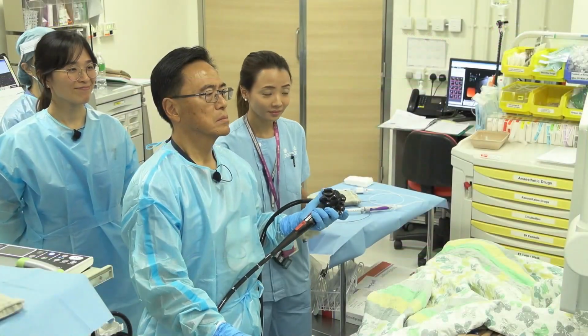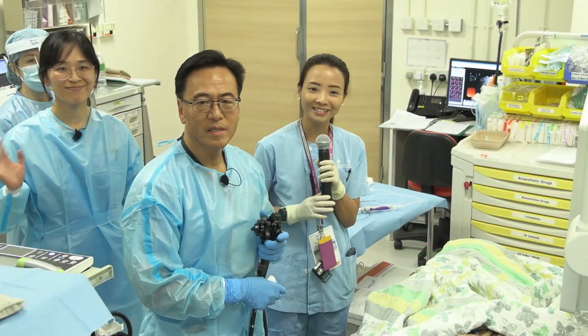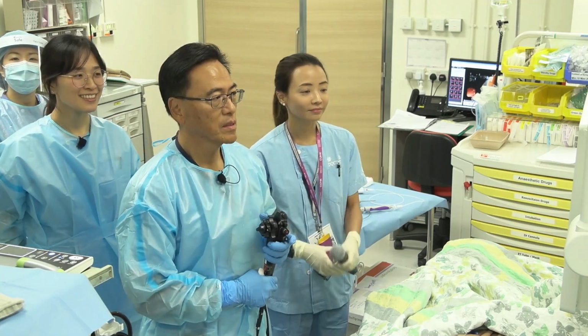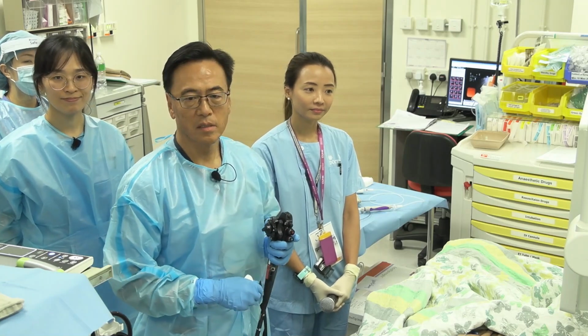Hi, Ken. Shannon. Hello, hello. Hello. Morning. Hello, good morning. Hi, Philip. Hi. So we learned about the case. So you are now starting the portal pressure measurement?